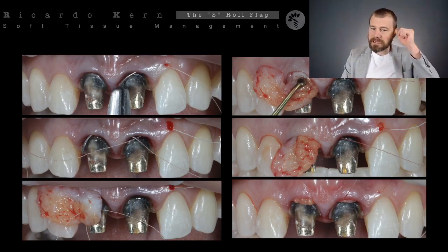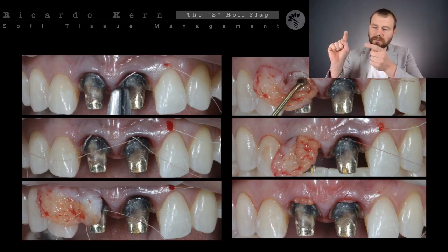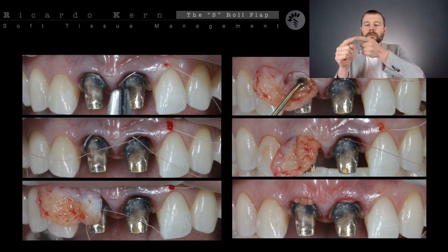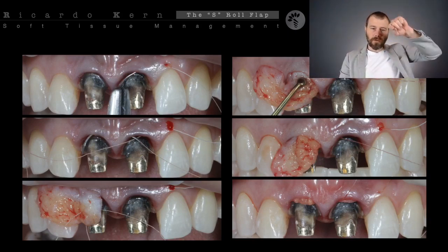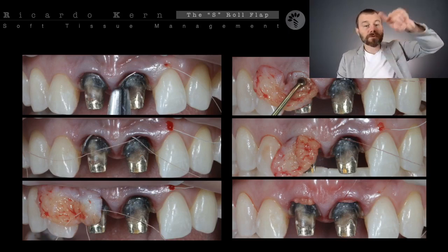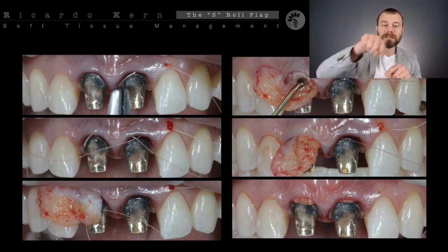We're going to see some slides about that, I think at the end of the presentation or tomorrow morning, on how to do these tricks to know exactly the proper area to engage the suture. So we came from the periosteum with the probe, we open room for the needle to run between the flap and the bone and emerge in the sulcus. Once you have one sulcus, you're going to run from one sulcus to the other with the back part of your needle in front, the non-cutting part of the needle, okay? So you move the needle backwards.